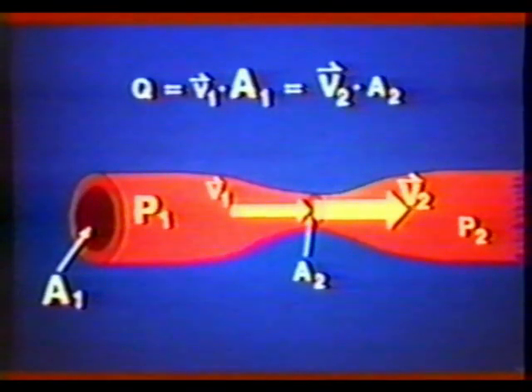In addition to volumetric flow calculations, the velocity of blood flow obtained during Doppler examination can also be used to calculate pressure gradients. With stenotic lesions, the cross-sectional area for blood flow is reduced at the site of stenosis. We have already seen that blood flow, here labeled Q, is found by multiplying the mean velocity of the blood flow times the cross-sectional area. Blood flow will be maintained at a constant level across the stenosis. That is, the blood flow proximal to the stenosis must be equal to the blood flow distal to the stenosis.